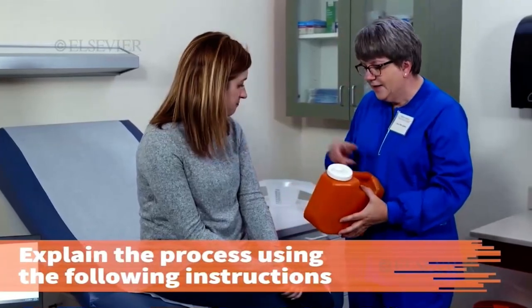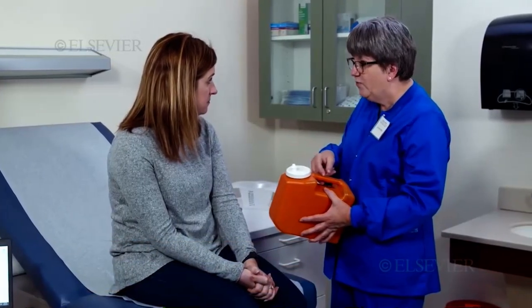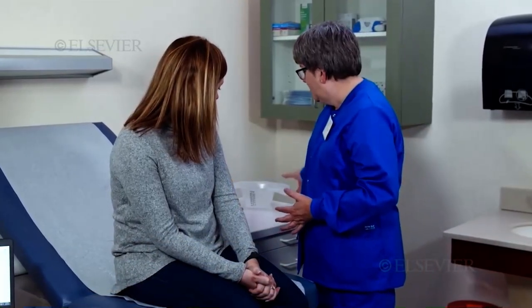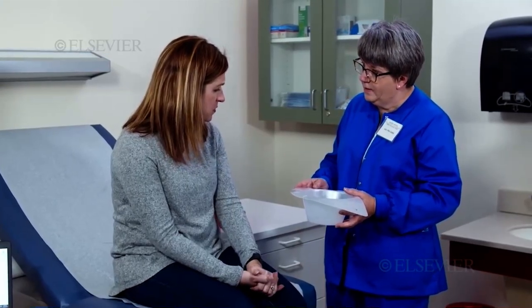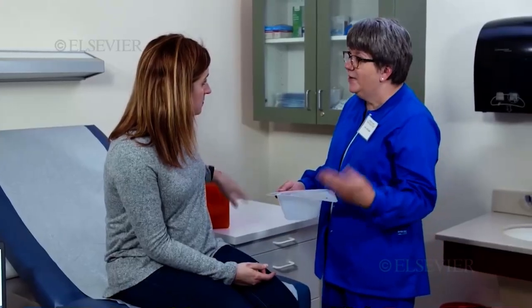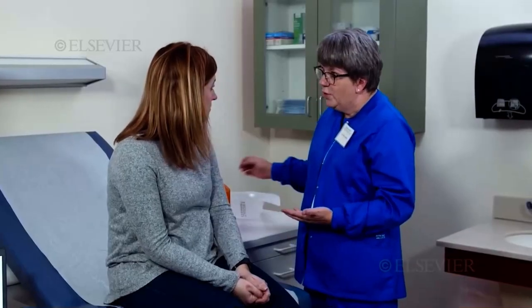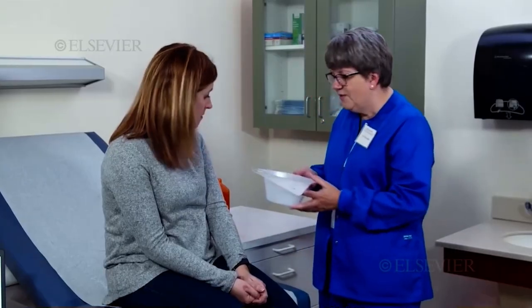First of all, you're going to have the collection container — this is going to hold all of the urine for that 24 hours. You're going to use this basin to actually collect the urine. Tell her not to urinate directly into the large specimen container because it may have a caustic preservative that could splash out while urinating. There's some preservative in this container that could cause burning or stinging, so you don't want to do it that way. You'll want to use the collection device.